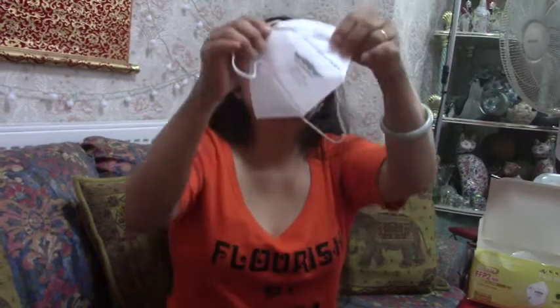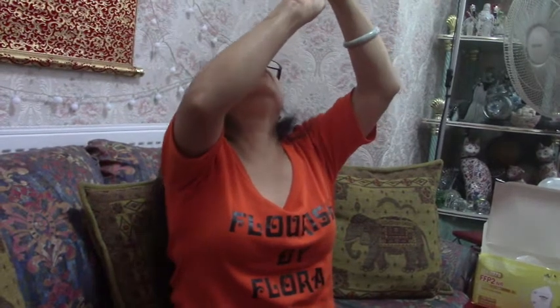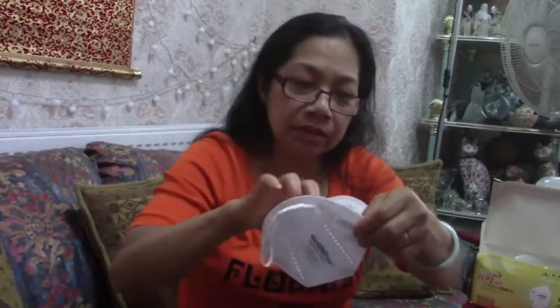But maybe it filters. I doubt it. Yeah, it's supposed to. Maybe the perforated part is filtering. Let's see if it's filtering. Can you actually see through the holes? No, there's something in between. Yeah, there should be filters. So there's a layer in between. So that is the filter, and that's good. I think it's still good, much better than the 3 layers. So this is okay, guys. This is a very good mask to use.